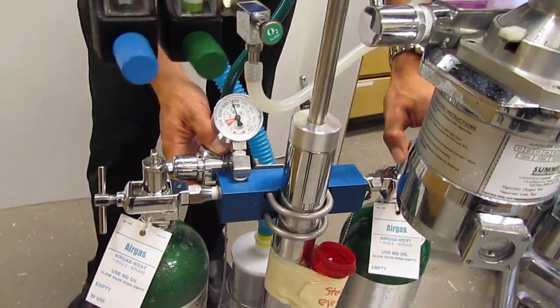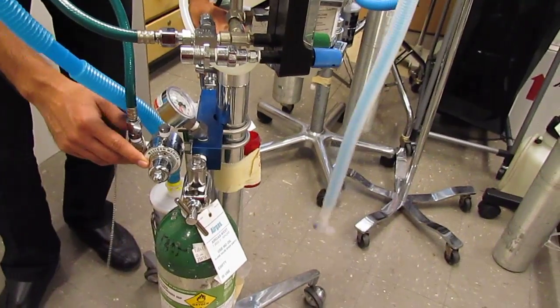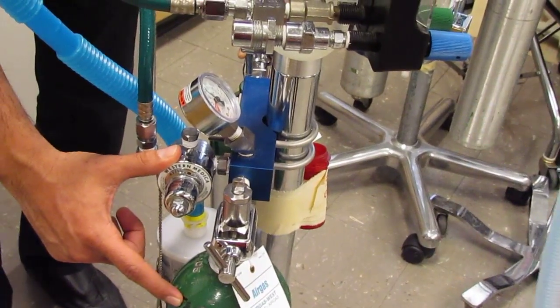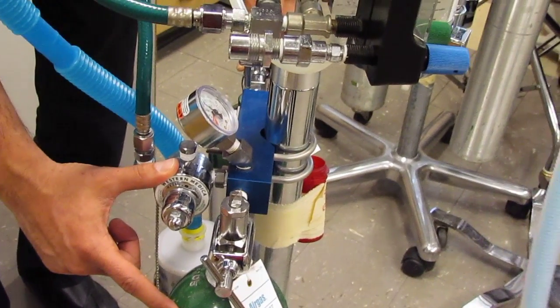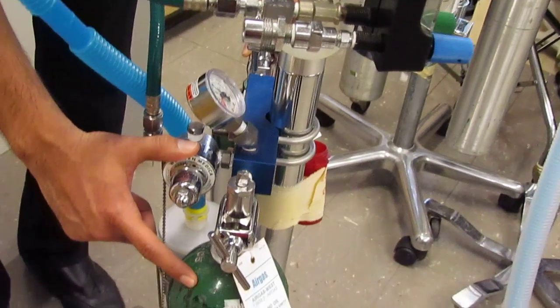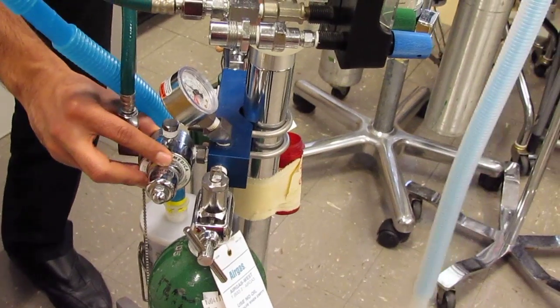Just behind that, we have our first major component, which is our pressure-reducing valve. The pressure-reducing valve reduces the pressure of the oxygen coming out of the tank from, let's say, 2,000 psi to 50 psi. If we only had 500 psi left in our tank, it still reduces it down to 50. So it reduces it down to about 50 psi.